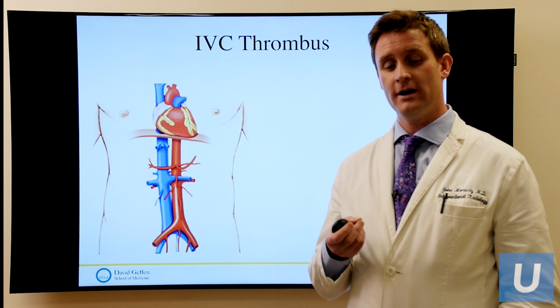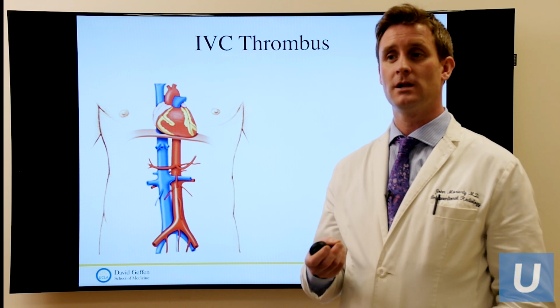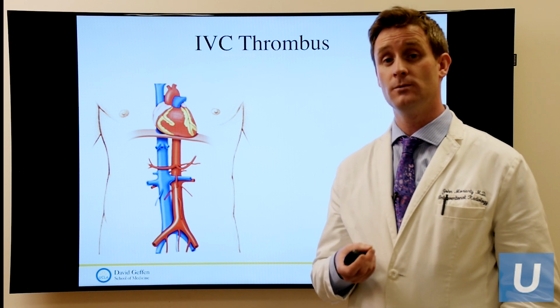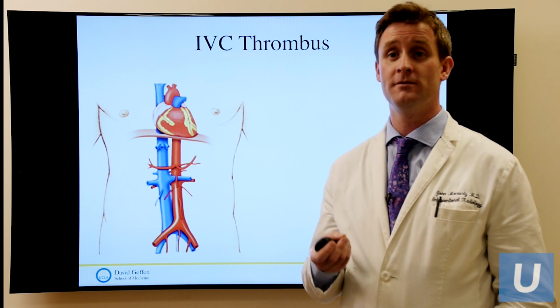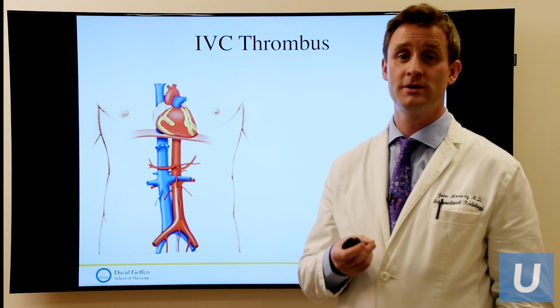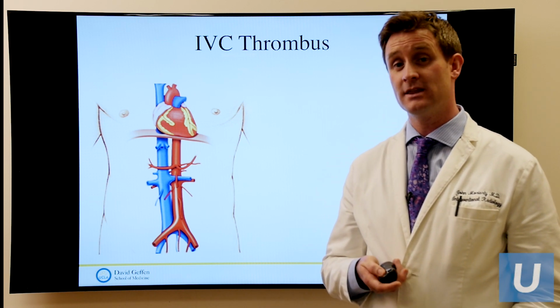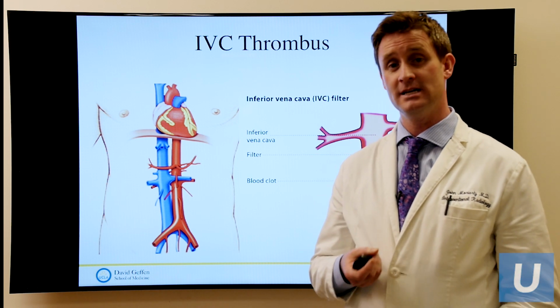And so there are people who develop clots there. There are people who are particularly prone to them. And there are ways that we have developed to either treat them or prevent clot from the legs moving through the cava up to places where it can cause this damage. And these would be things like IVC filters, which you can see here on the screen.